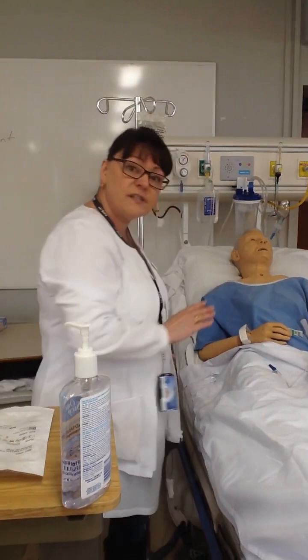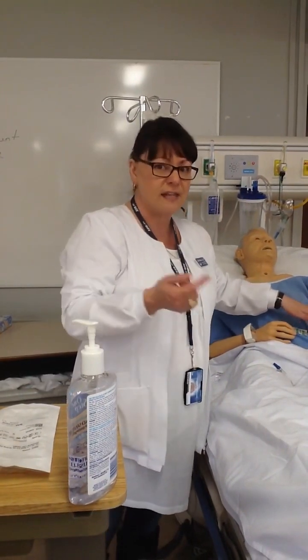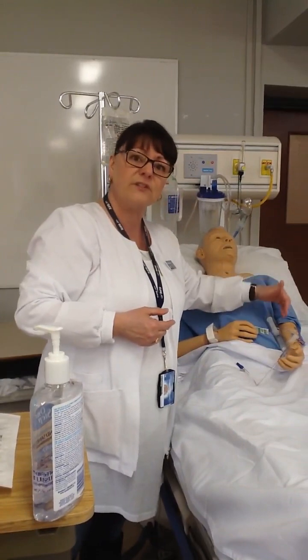We start at the insertion site. We're looking for any signs of leakage, infiltration. Has that catheter slipped out of the vein and now it's in the tissues? Or phlebitis, is it red and warm? Is there irritation in the vein?